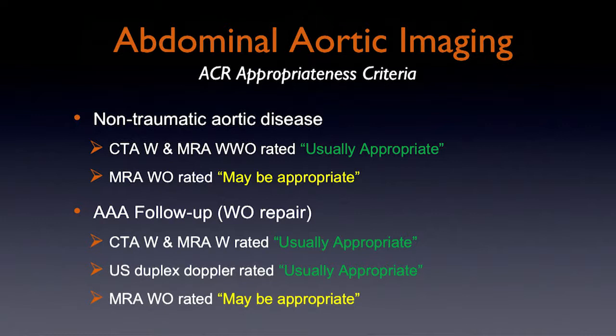Arguably, from all of the guidelines we have, CT and MR angiography are rated similarly as usually appropriate for non-traumatic aortic disease, as well as AAA follow-up, so patients who have not undergone repair but are being reassessed to evaluate the size of the aorta and any growth.